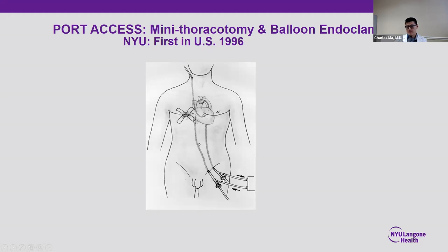You had an arterial cannula that had an endoballoon that acted as a cross clamp, so you can arrest the heart and deliver cardioplegia through this balloon device, antegrade to arrest the heart. And then you had a venous cannula that drained the heart. So this was effectively your cannulas for bypass machine. You can do that through the groin percutaneously. You can stop the heart and do a repair through a mini thoracotomy incision.